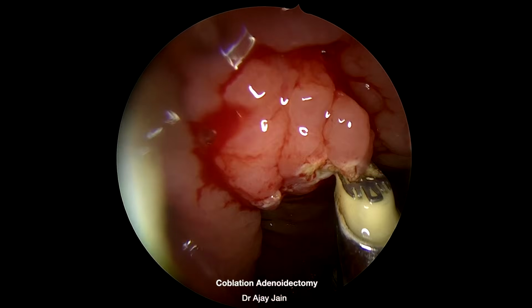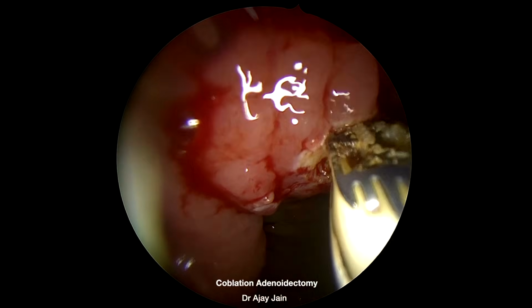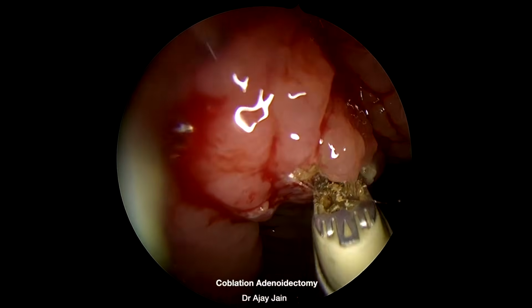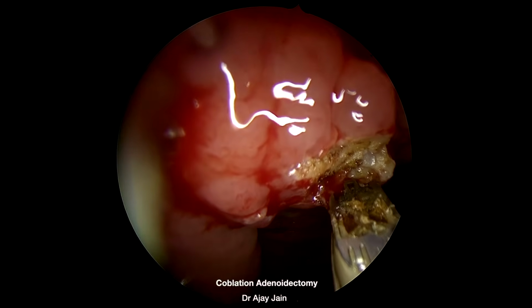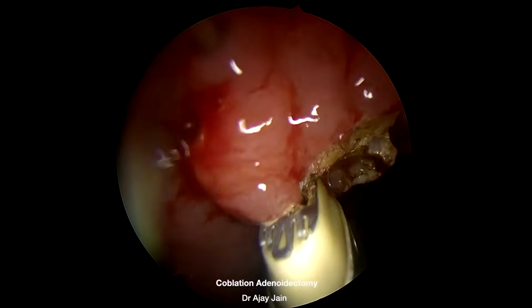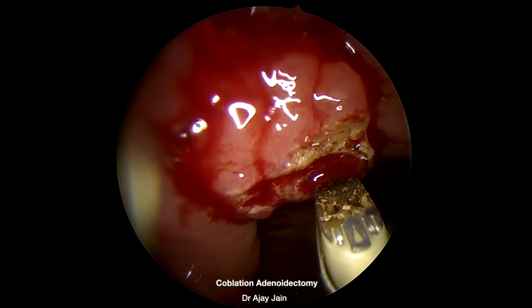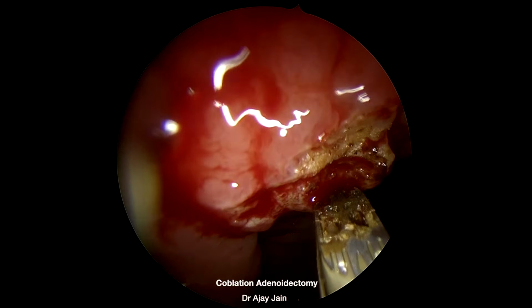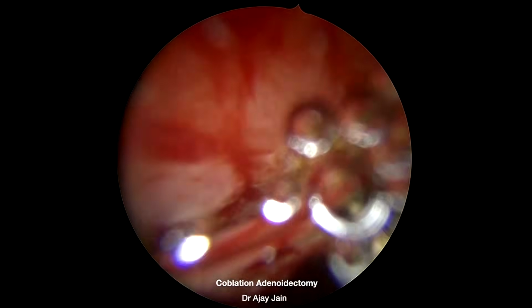The adenoid tissue was enlarged, extending up to the eustachian tube cushion, but adenoids are not obstructing the eustachian tube. At the time of the surgery, the adenoids had reduced slightly following resolution of acute infection, though adenoids were obviously enlarged when she had active infection and she had frequent infection.